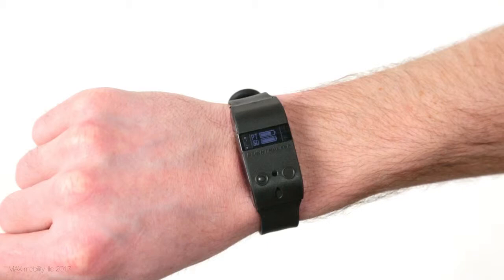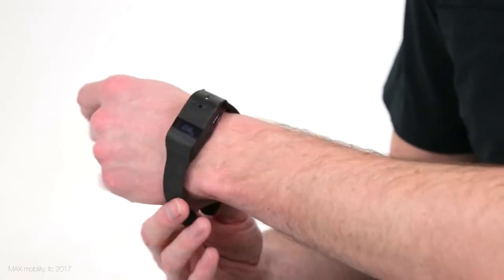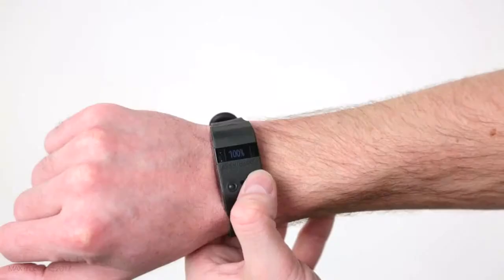We encourage you to charge the battery every night to avoid running out, and the battery life won't be affected by charging when it is partially drained. It is splash proof, but you'll need to take it off before showering and be sure to blow out any water or dirt before plugging in the charger.